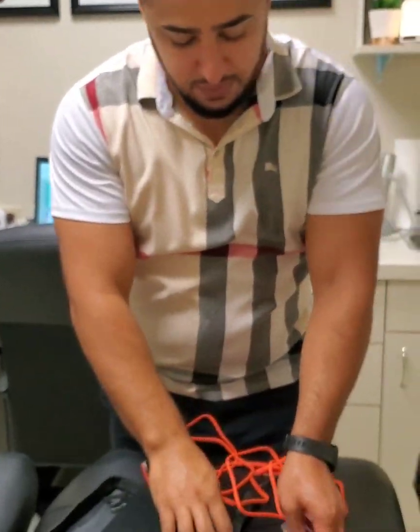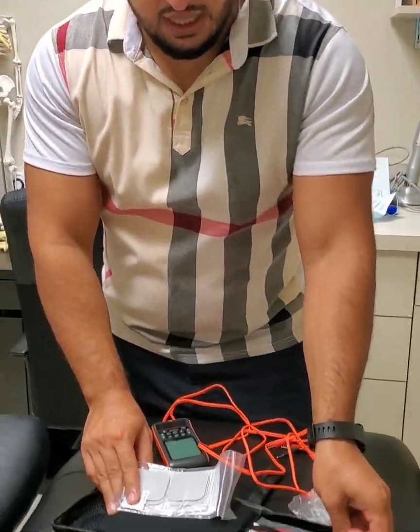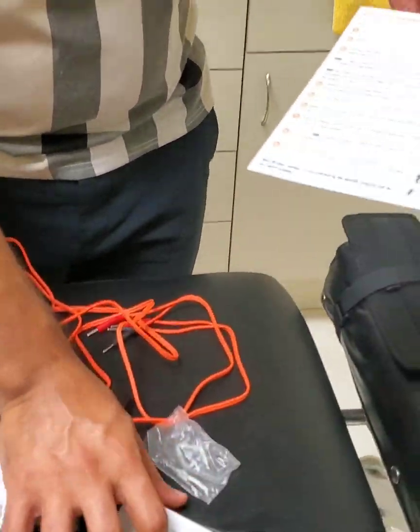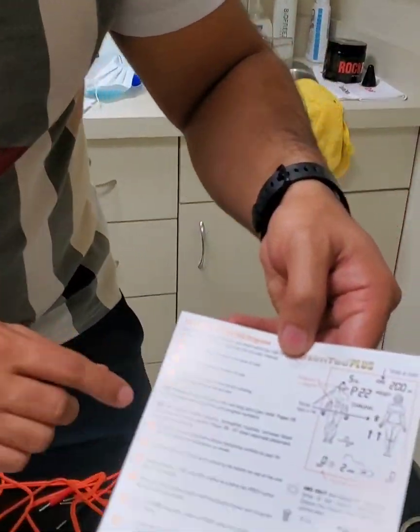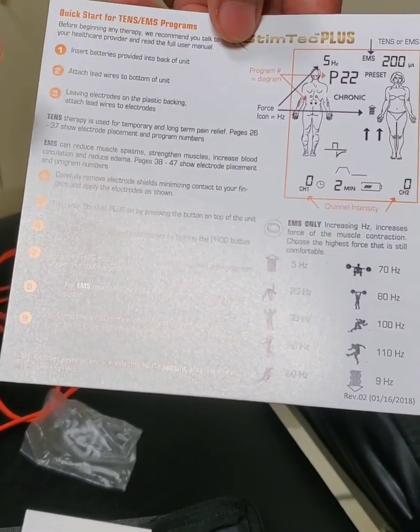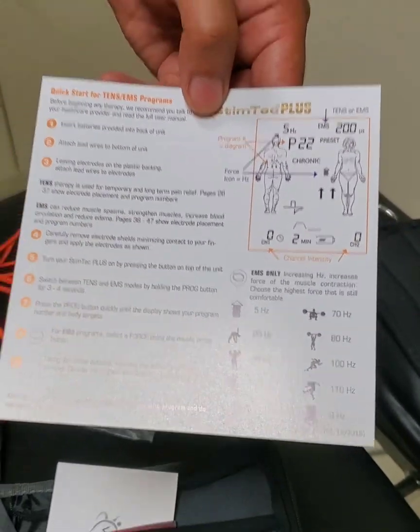Next thing is you have these electrodes. Everything I'm explaining right now is going to be on this little card over here — one side is in French and one side is in English. It goes in order: attach the batteries, put in the electrodes, and then it tells you the difference between the TENS and the EMS settings.